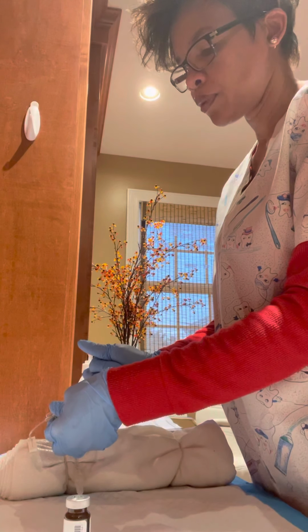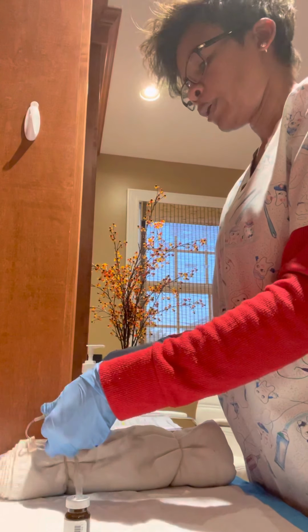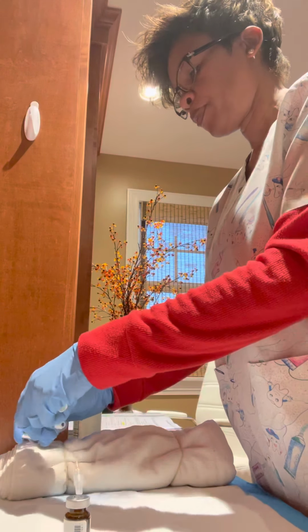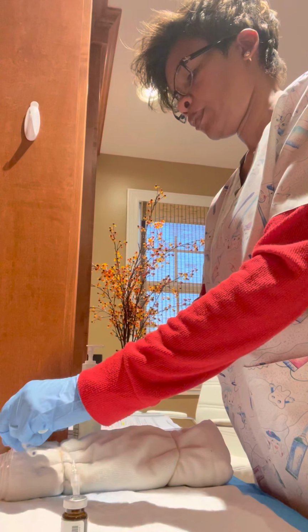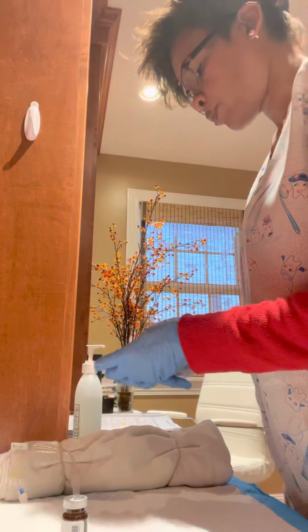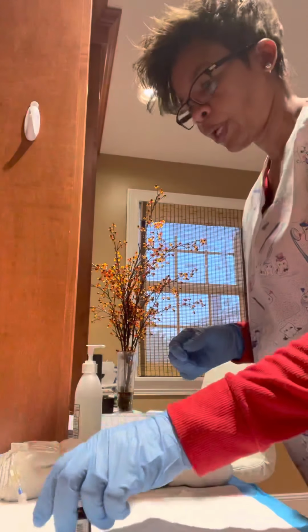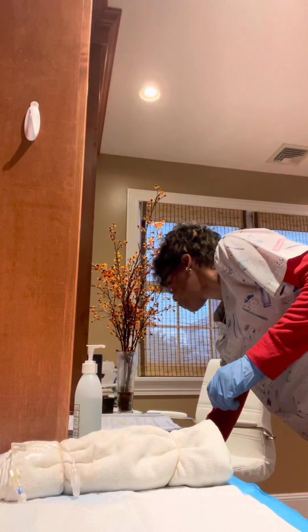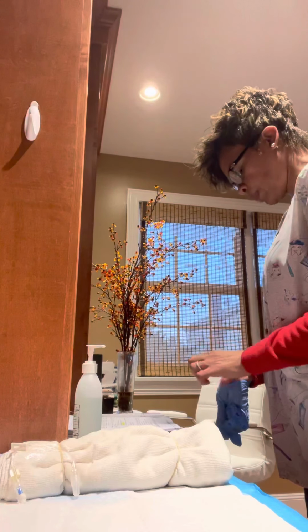Okay, so I do the flush, it's tolerating everything well, and then I would just clamp the IV, ask her if she needs anything, and I would just clean everything, remove my gloves.